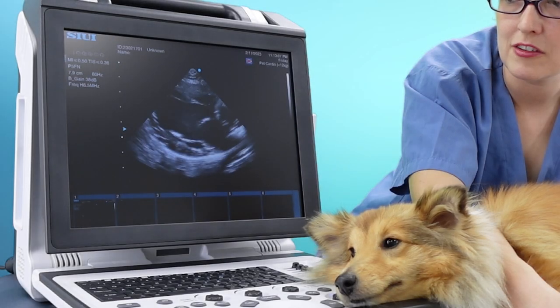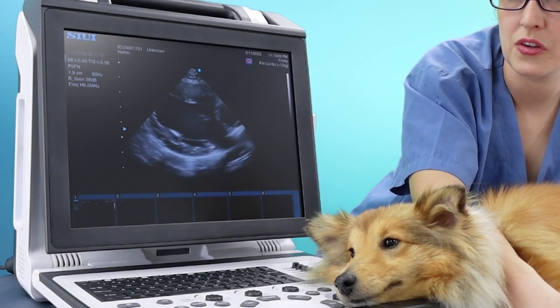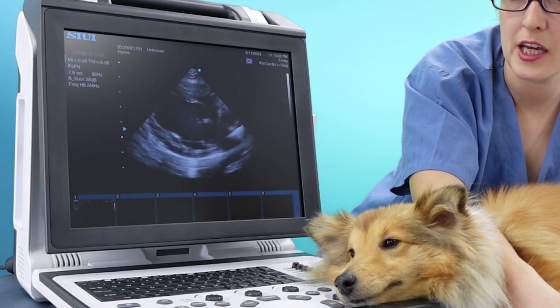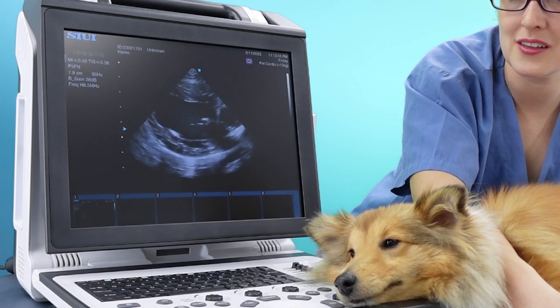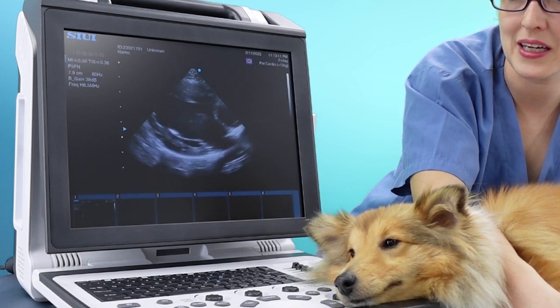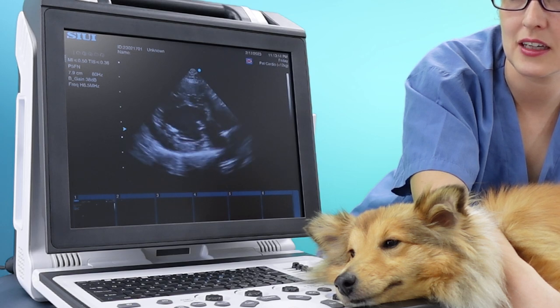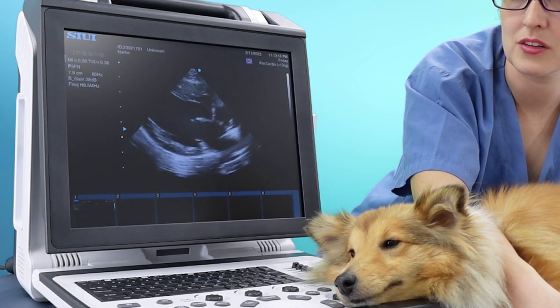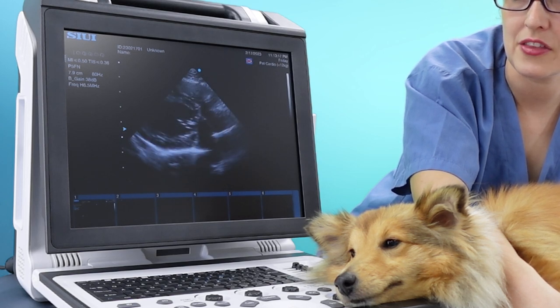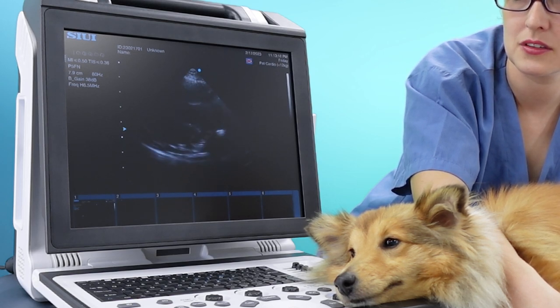If your left ventricle looks somewhat circular and the apex is squeezing towards the base, then you'll need to rotate your hand anticlockwise to lengthen it out.